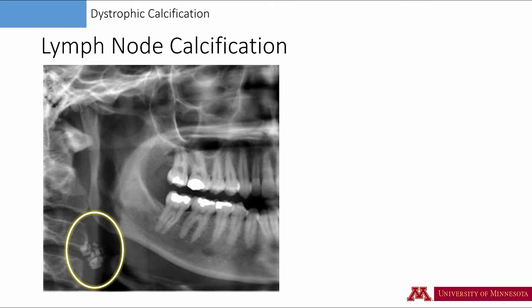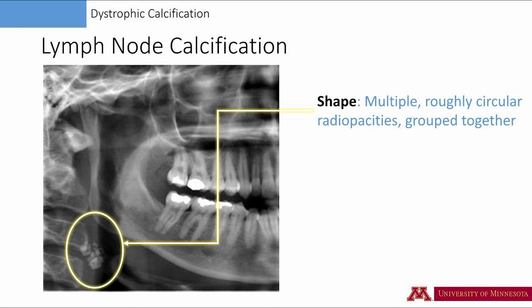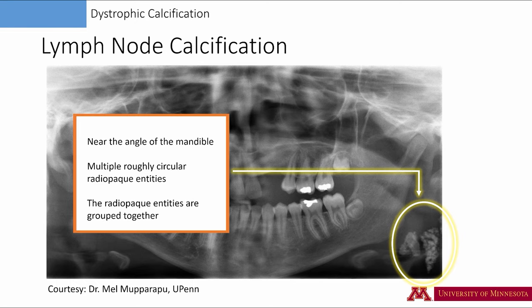Here is one example of lymph node calcification. The location is critical for the diagnosis. The radiopacities are near the angle of the mandible — multiple, roughly circular radiopaque masses that have grouped together. The imaginary outline is almost oval. You may visualize these calcifications similar to a bunch of grapes. This is another example of a lymph node calcification — again multiple radiopaque masses grouped together, giving an appearance of a bunch of grapes. The location remains critical for the diagnosis. These calcifications are near the angle of the mandible, and we see these masses are superimposed over the hyoid bone.